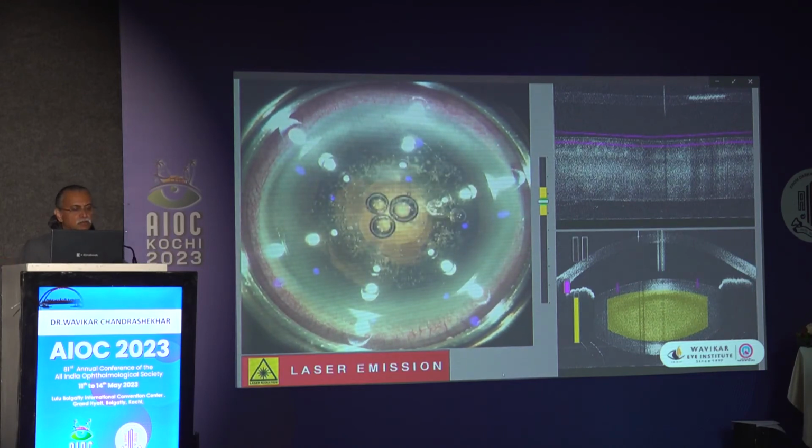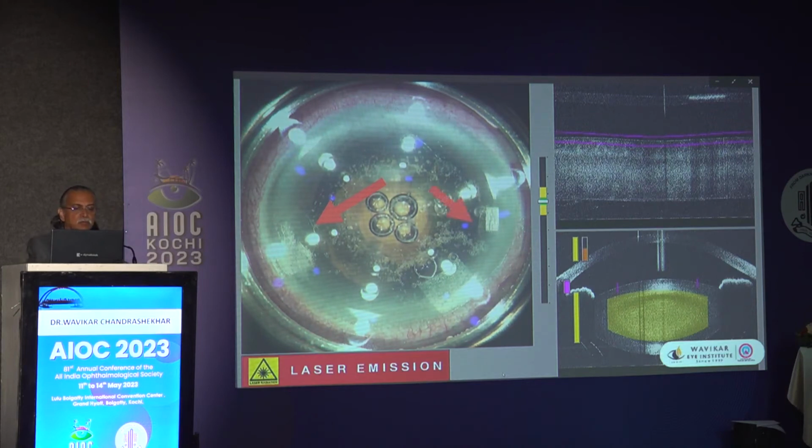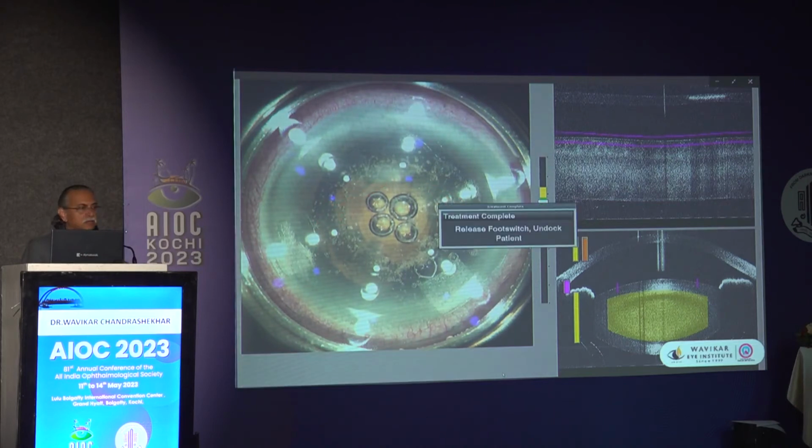That is when we started observing our surgery videos more carefully for any signs. You can see, even in a case where we did not have Descemet detachment, there are signs. Luckily, these complications are very few. You can see one air bubble over here, that arrow. Similarly, there is one more air bubble over here. We call it the immobile air bubble sign.